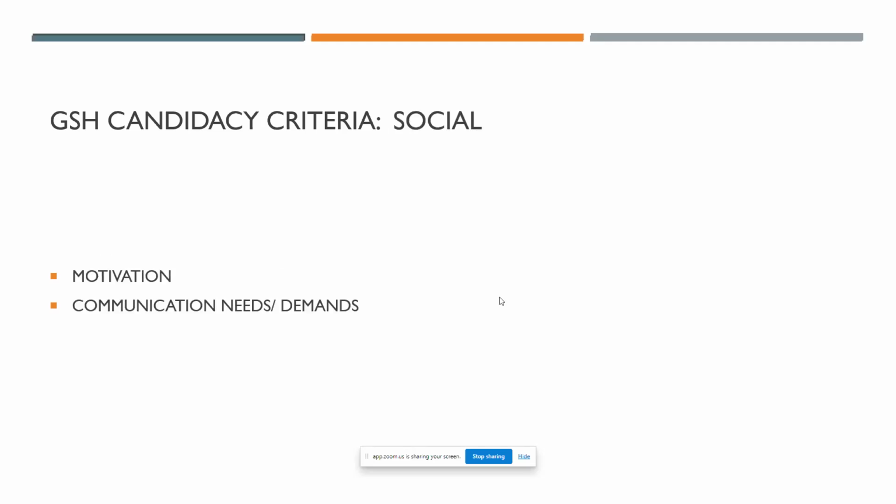And from a social perspective, basically, we want to look at the fact that if we are giving this device to this person, is it something that is actually going to improve their current circumstances, or is it just going to continue to make their lives a little bit more complicated? And we attach that to the financial part of it because of the maintenance that is related to these devices.